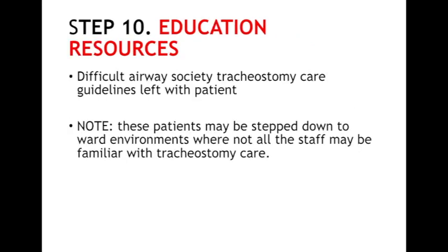It is also important to remember that these patients may also be cared for by staff not completely familiar with tracheostomy placement, and appropriate educational resources should be available both with the patient and online to ensure that safe care is continued.